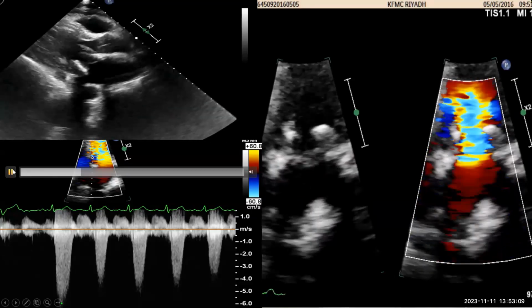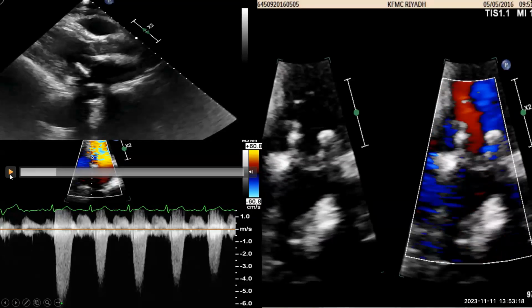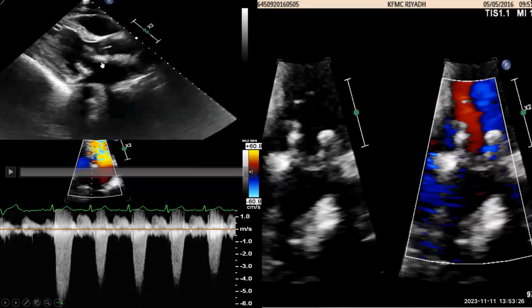You can appreciate that it's very common to bring you a prosthetic mitral, aortic, or tricuspid valve. So how can we differentiate whether this is metallic, I mean mechanical, or just bioprosthetic? By many features, mainly in 2D. In bioprosthetic, we don't have metallic shadows, we don't have reverberation artifacts, as we see here. And we have what?